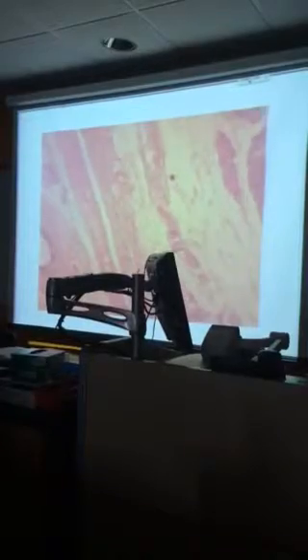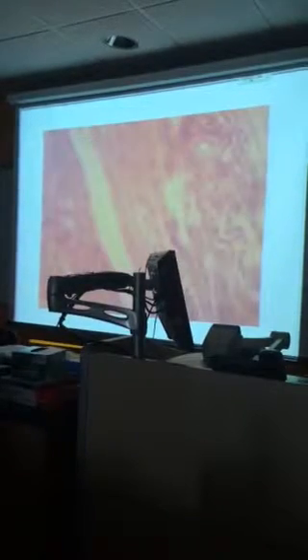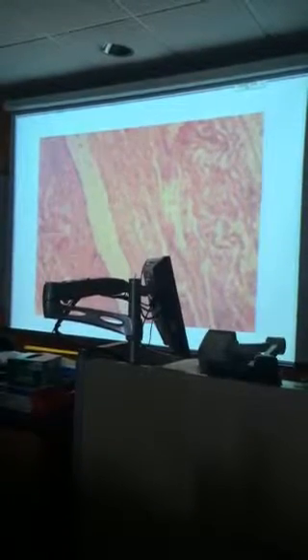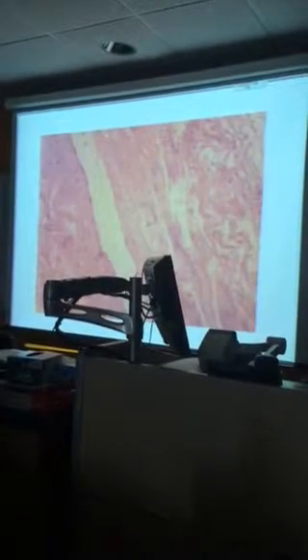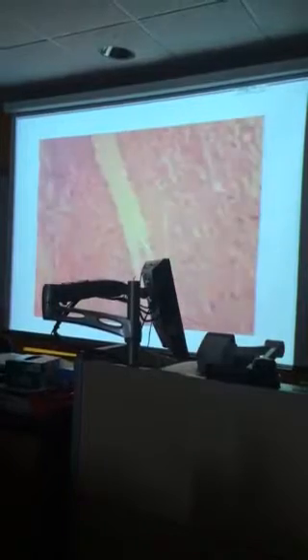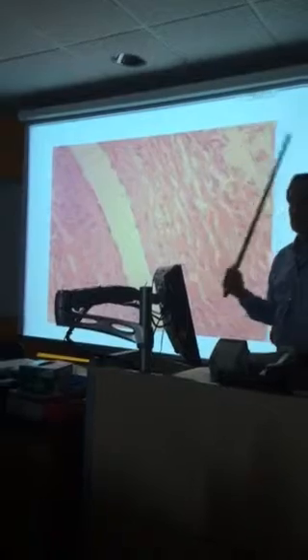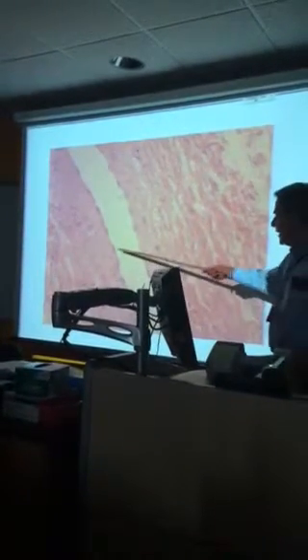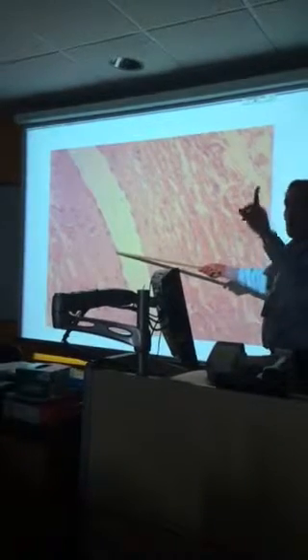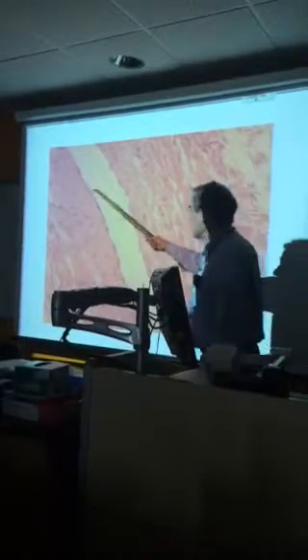Okay, we got a couple cavities here. And here's one of them. What is this? Is this a salivary gland duct, or is this a blood vessel? And how do you know? What is it? How do you know it's a blood vessel? It's squamous, not cuboidal. Look at the lining. Flattened nuclei, one cell layer thick. That's simple squamous epithelium. Very clear, right here.